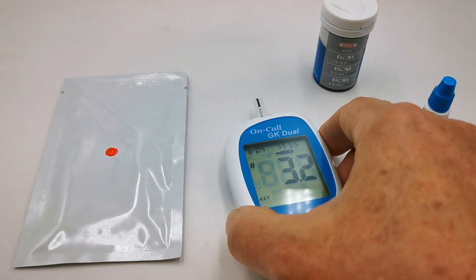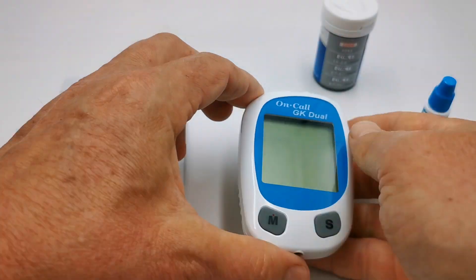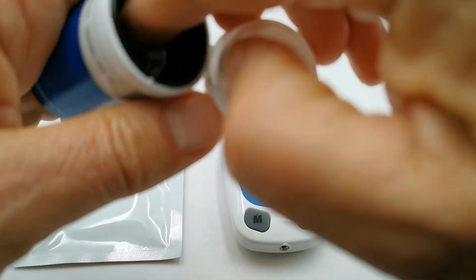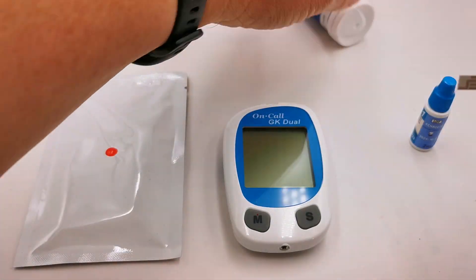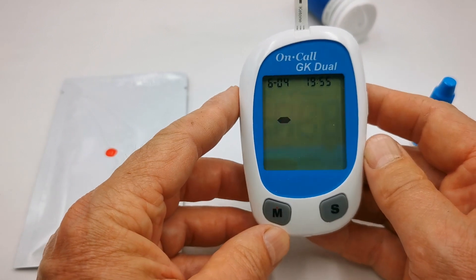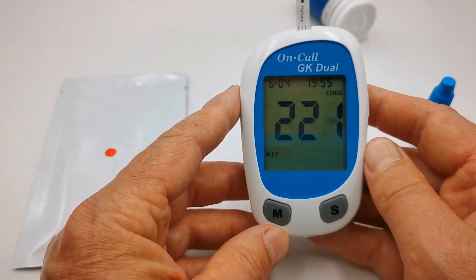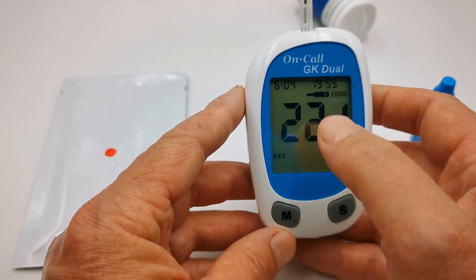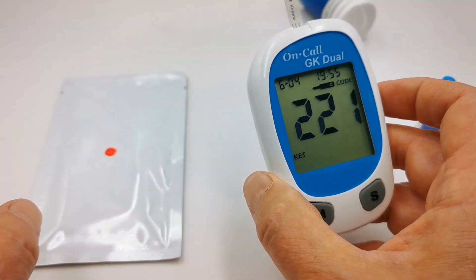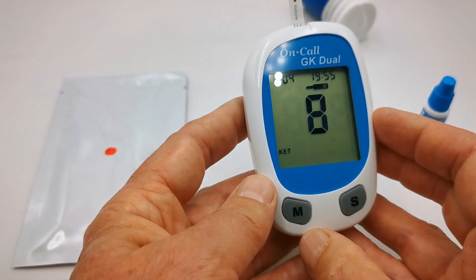Let's repeat that test to make sure we're getting consistency. I'm going to eject that test strip, place another test strip into the meter, wait for it to recognize the strip, then press M to get it into check function, and again dip it into the test solution.